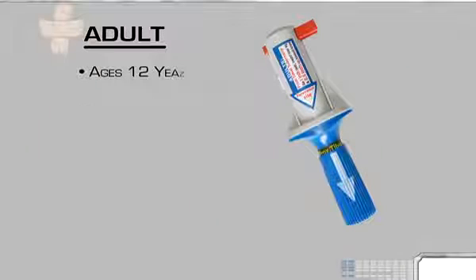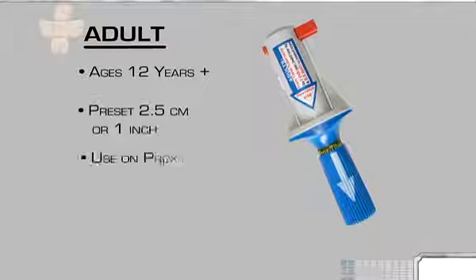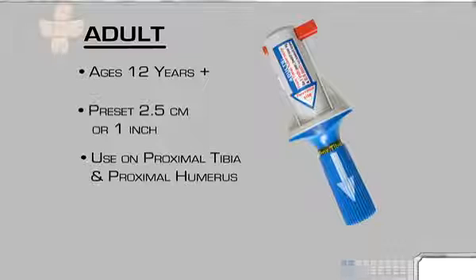The adult BIG is intended for use on patients age 12 years and up, is preset to an insertion depth of 2.5 centimeters or 1 inch, and can be used in both the proximal tibia and the proximal humerus.